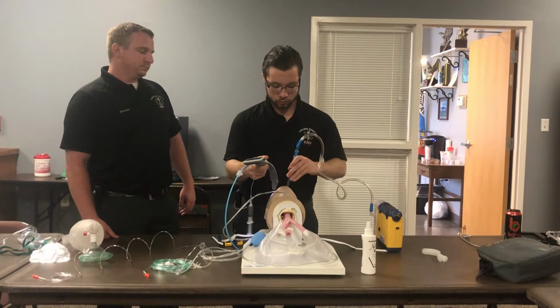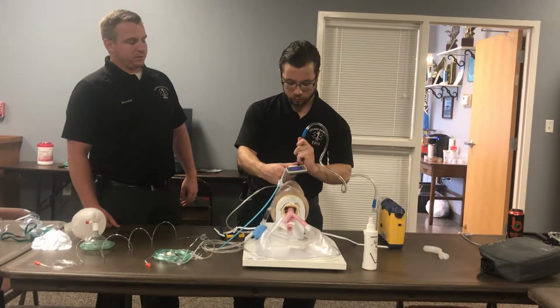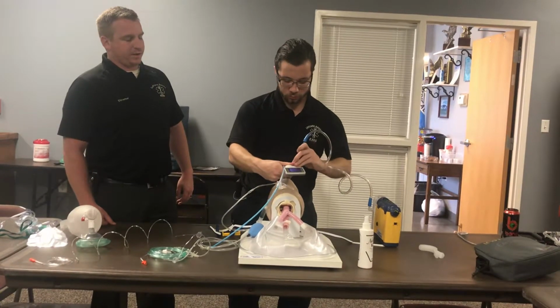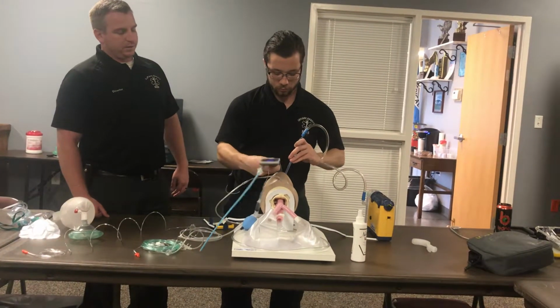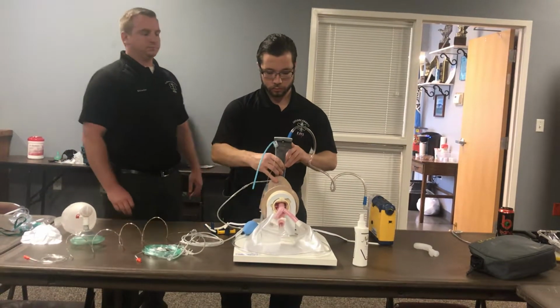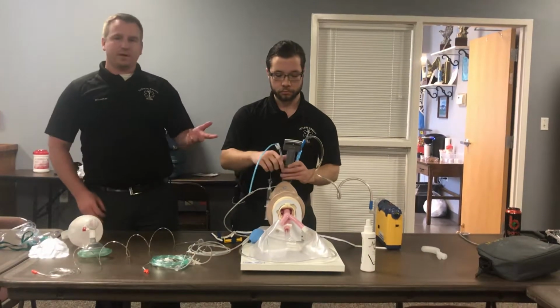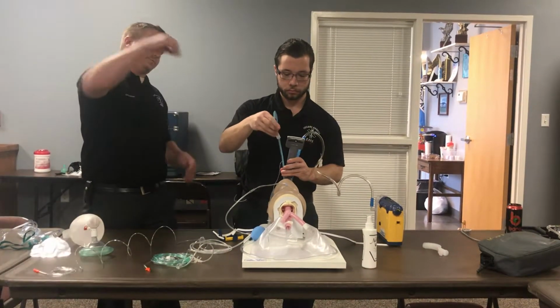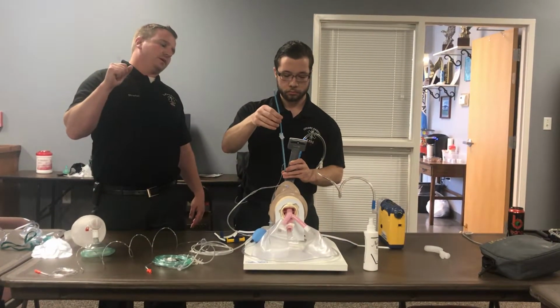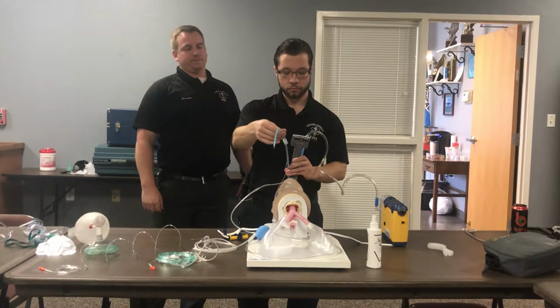Alright, so now he's going in for his intubation procedure. He's using the suction device to help get the tongue out of the way and make sure that when the King Vision goes in, it's nice and simple. Remember, this is not a displacing device. You're not trying to move tissue out of the way. You're simply looking around the patient's airway. He's got a really good view of the cords right now.